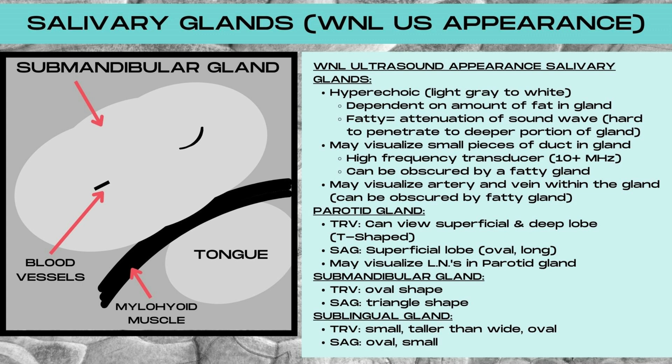The submandibular gland in the transverse view is oval in shape, and in the sagittal plane tends to be slightly triangular shaped. The sublingual glands are small on ultrasound, and in the transverse plane they will be an oval shape turned on its side, making it taller than wide. In the sagittal plane they'll appear oval, small, and wider than tall.